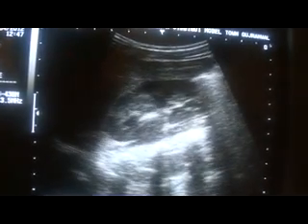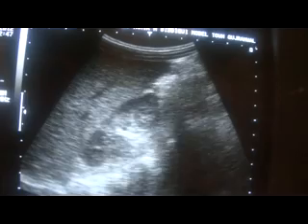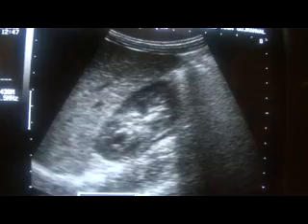This is the coronal section of the right kidney, which is going normal. So now, where is the gallbladder? This is the gallbladder. This is the gallbladder and this is the portal vein.